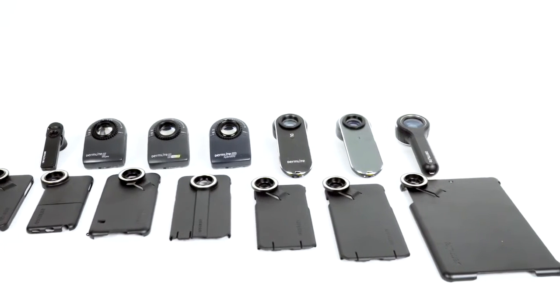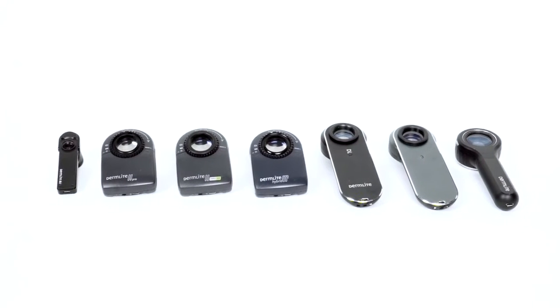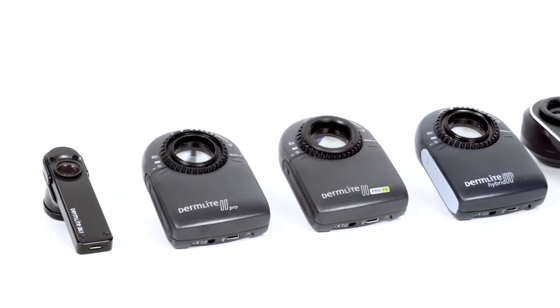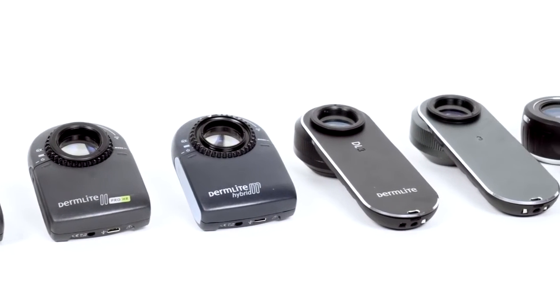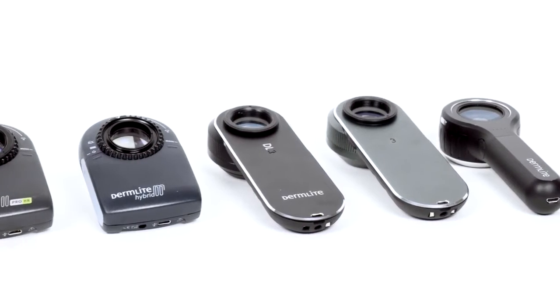Welcome to the DermLight Magnetic Connect and Connection Kit assembly tutorial. In this video we will demonstrate how to properly use the Magnetic Connect system with the DermLight 1, DermLight 2, DermLight 3, and DermLight 4 dermatoscopes.